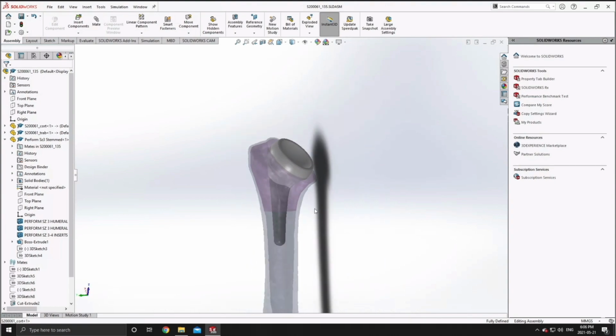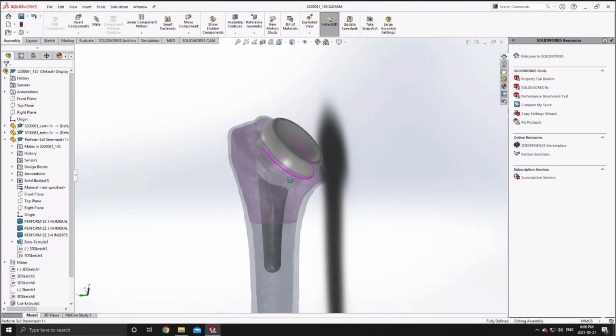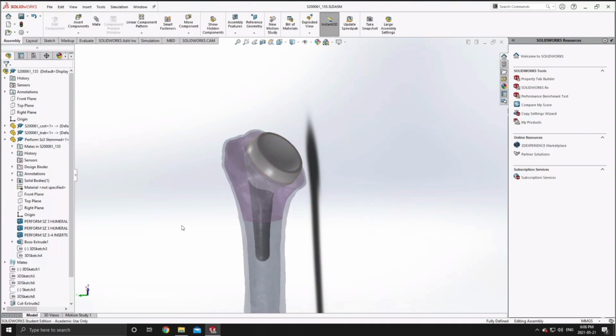Now, moving forward, this file is just exported as a STEP 214 document, and that is now readable by Abaqus, so you can bring it into whatever FEA software you're going to be using and begin to do whatever evaluation you're planning on doing with your finite element analysis software.